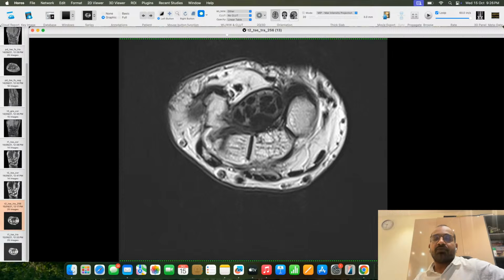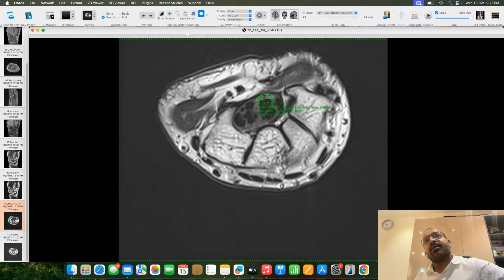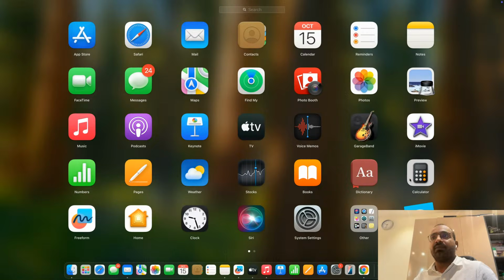So we see more than 1.4. Then there is something called the flattening ratio that you can take, because these two nerves are together and almost inseparable at the level of the hook of hamate. Here we can do the flattening ratio in a combined way. I should take the width and the height, and divide width by height.